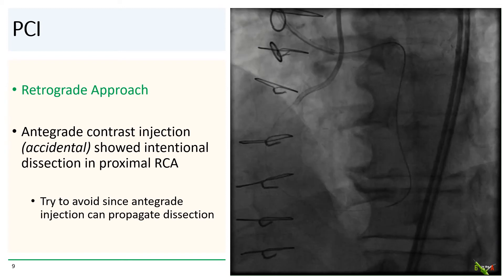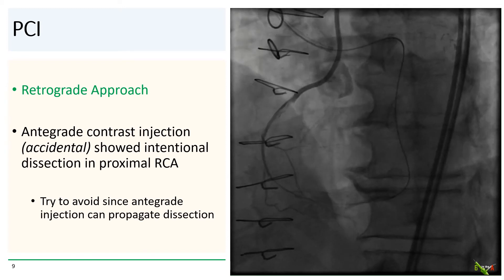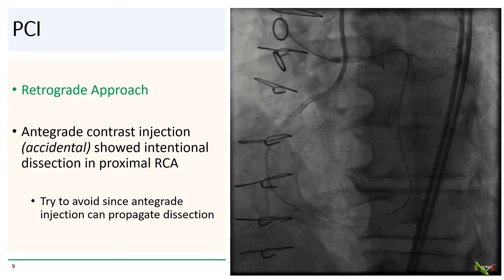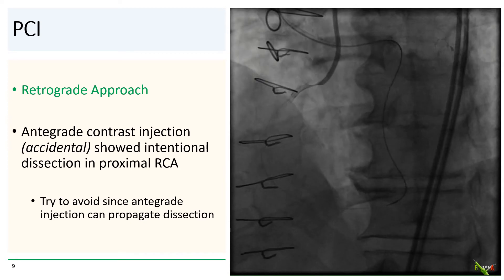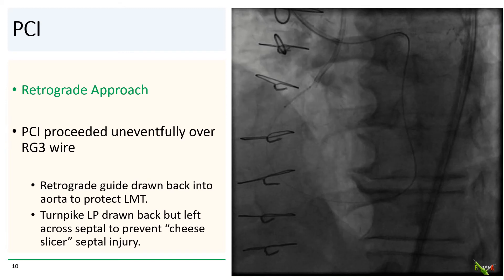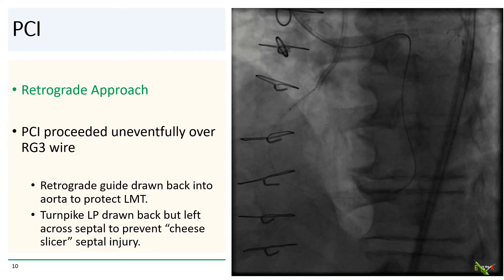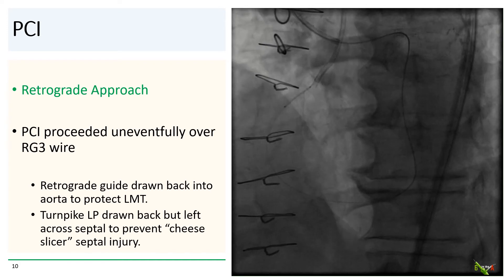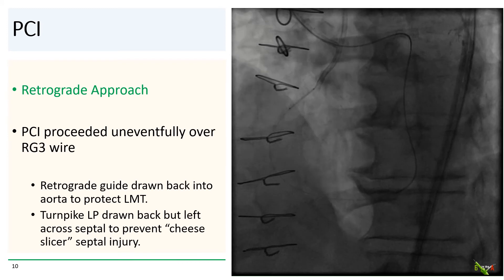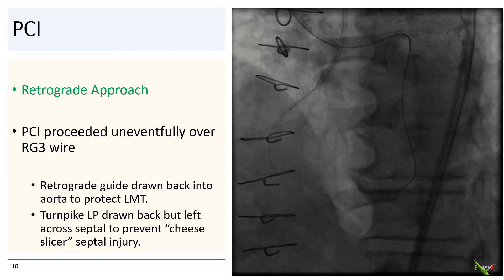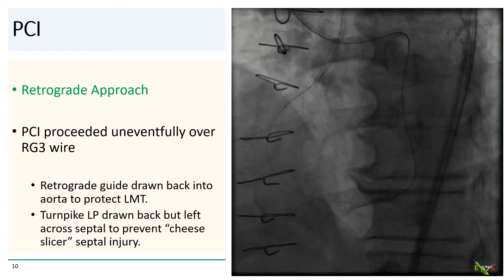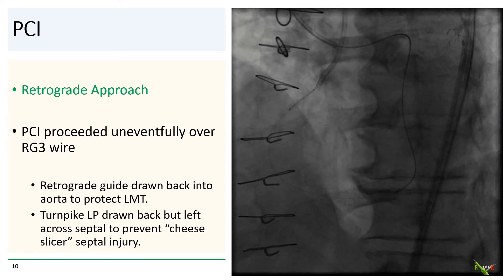An accidental contrast injection here demonstrated the intentional dissection in the proximal RCA. This is a bit of an oopsie, as an antegrade injection at this point can hydraulically propagate the dissection — thankfully, that was not the case here. Note that we intentionally pulled the retrograde guide back into the aorta to protect the left main, and the Turnpike LP was pulled back to allow stenting but was purposely left across the collateral to prevent the septal injury from a cheese slicer effect that can happen with force on the externalized wire.